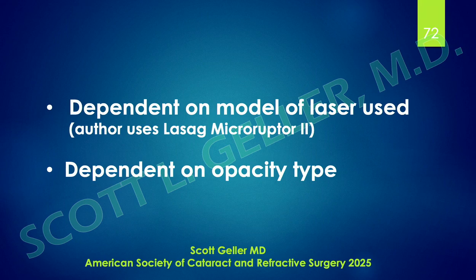Laser treatment parameters, well, that depends on the model of the laser used. I use a Lasag Microruptor 2, which I consider to be the world's best top of the line. And of course, it's dependent on the opacity type.